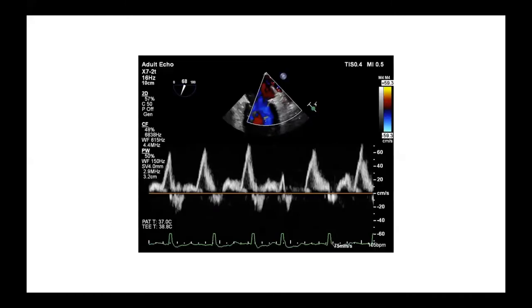Here we have a pulmonary venous flow on the left upper pulmonary vein, which shows systolic blunting of the S-wave, implying at least moderate MR. Good practice is to try to evaluate more than one pulmonary vein for a more accurate measure of mitral regurgitation — you may not see blunting in one vein but may see it in two or more.